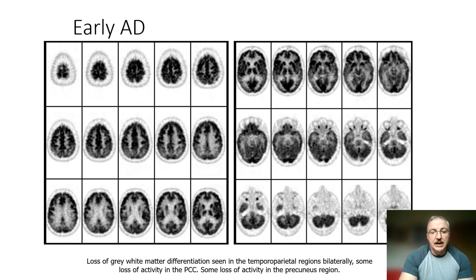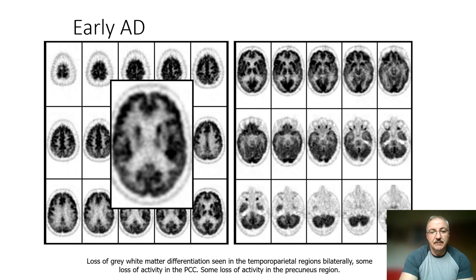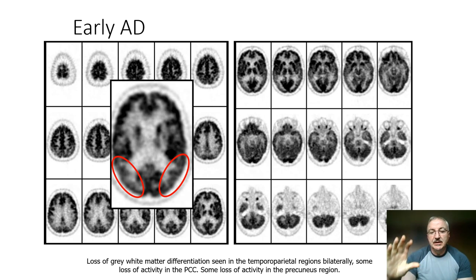Let's see if we can see any difference in an early Alzheimer's disease case, displayed in exactly the same way. At the level of the body of the caudate nuclei, we can see comparatively reduced activity within the right and left parietal lobes. This is mild in that the gyral pattern is maintained, but it is all reduced. We also see reduced activity within the right and left posterior cingulate gyrus; the comparator here is the activity within the thalamus.